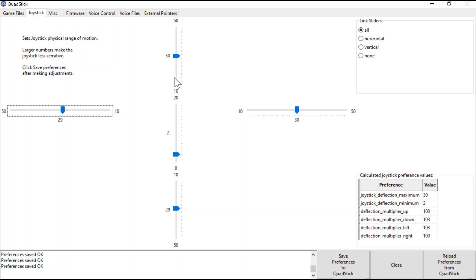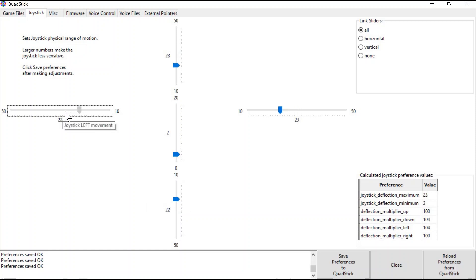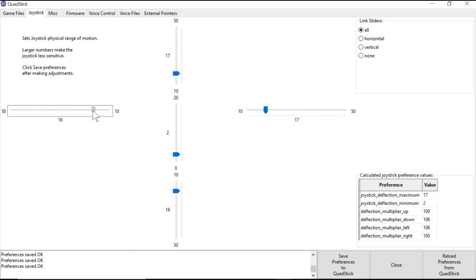Each of these sliding bars corresponds to the different directions of the Quadstick joystick. By sliding this blue knob up and down on the sliding bar, you can make the joystick more or less sensitive. Lower numbers correspond to a more sensitive joystick, requiring less movement to move your player, whereas higher numbers correspond to a less sensitive joystick, requiring more movement.